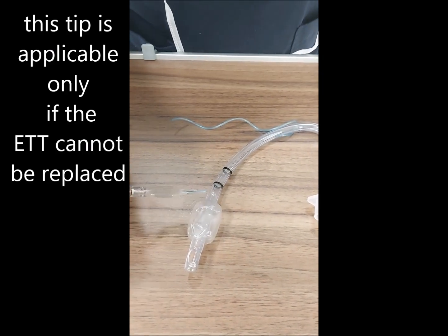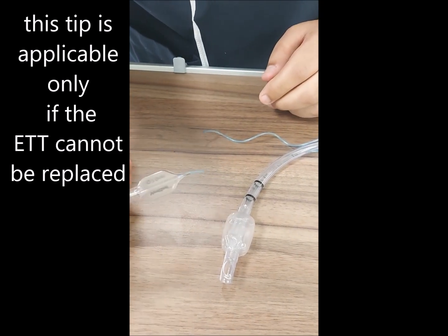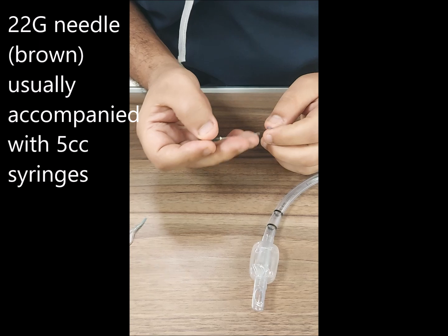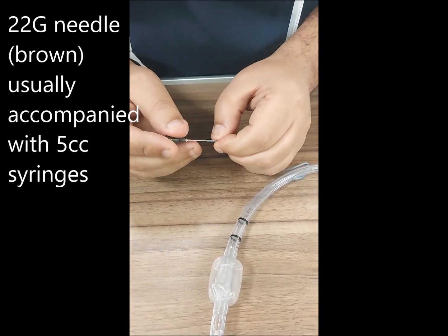This video is to correct the problem of cutting the tube, the cuff, by accident. It's very simple. You can correct this by putting the 22 gauge needle inside the connection here.